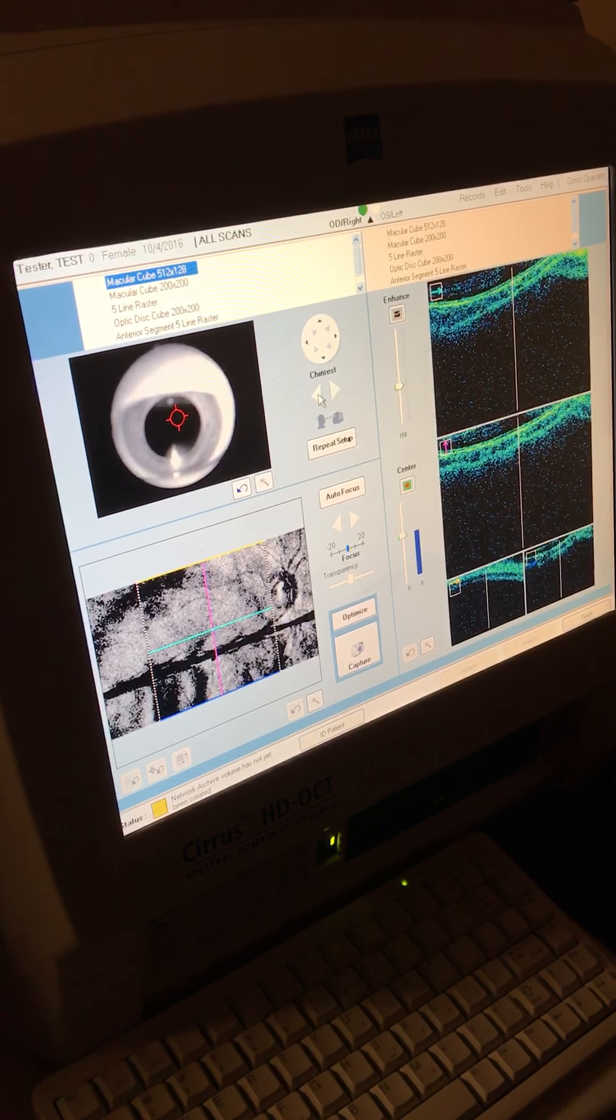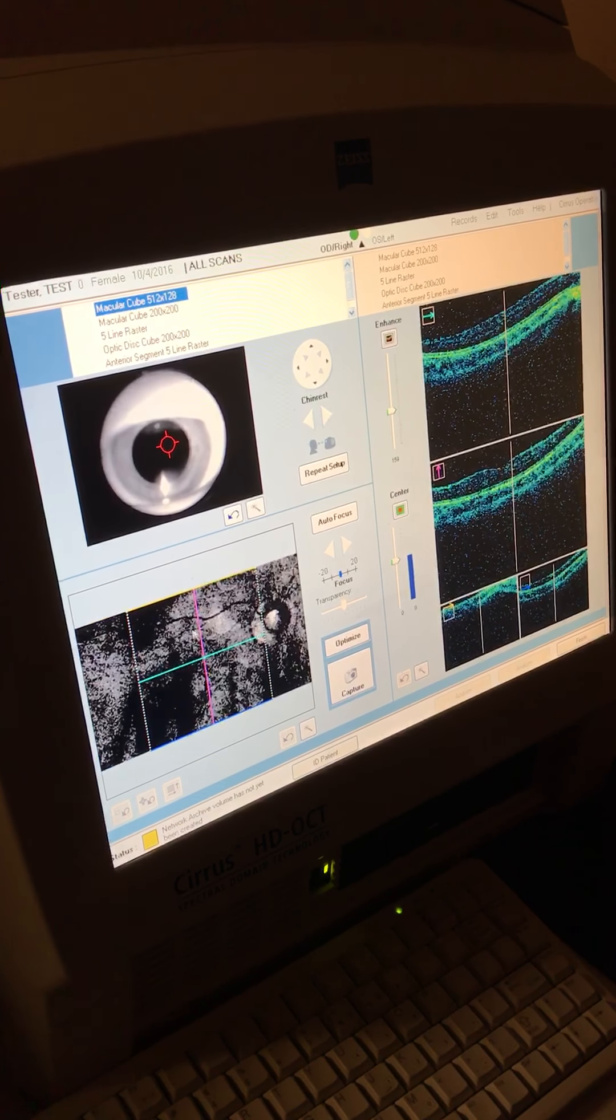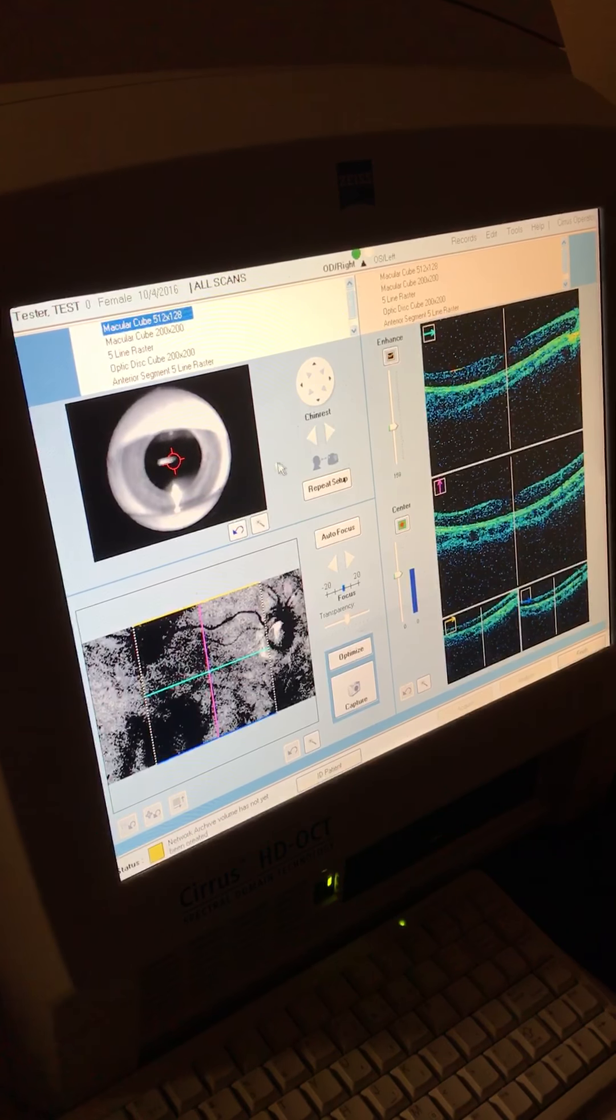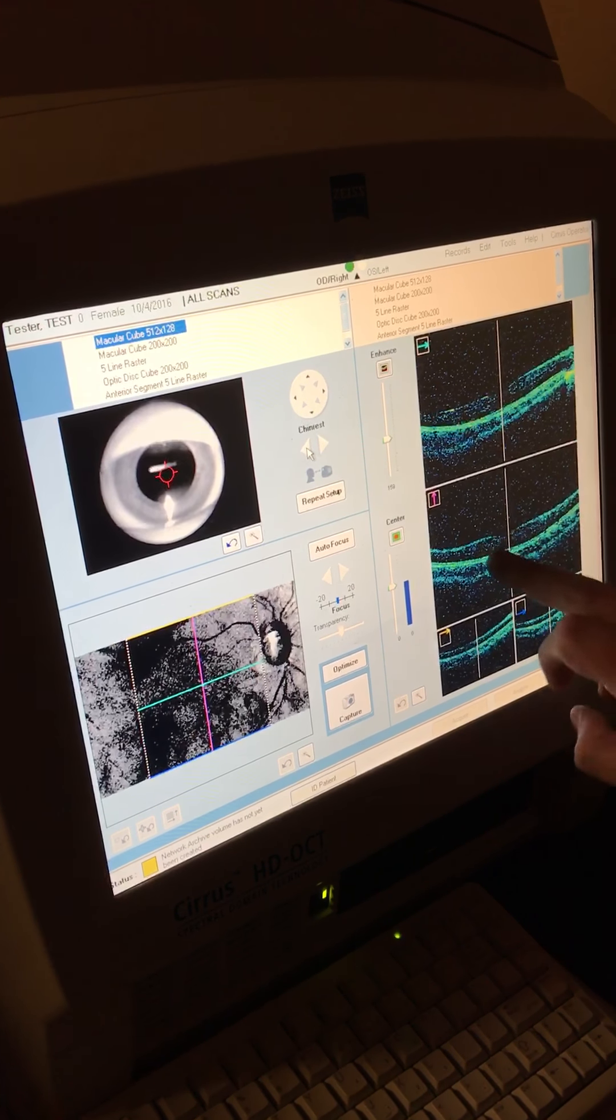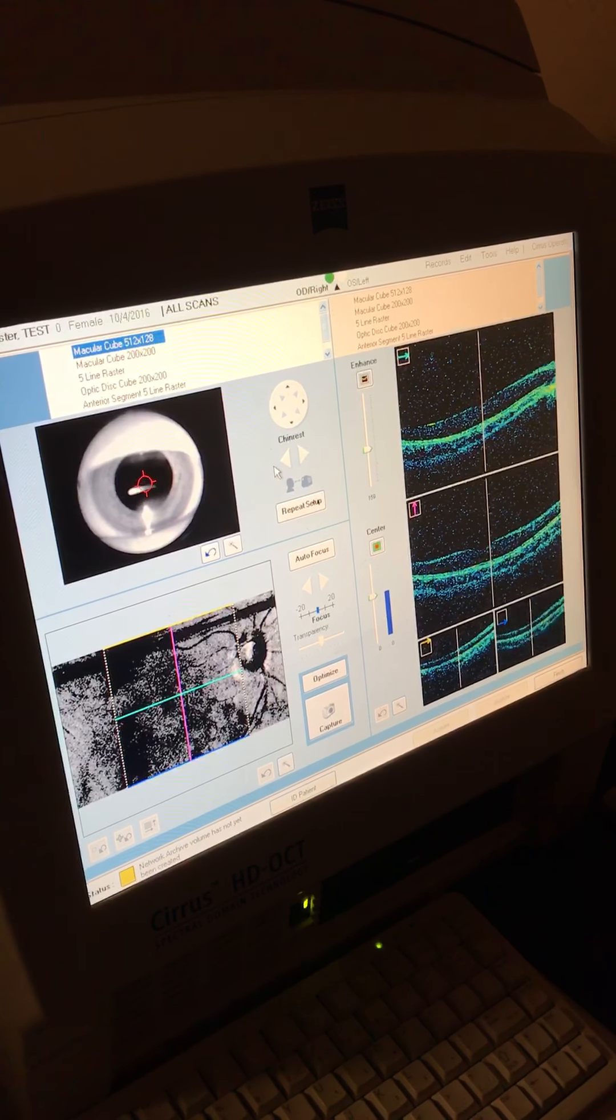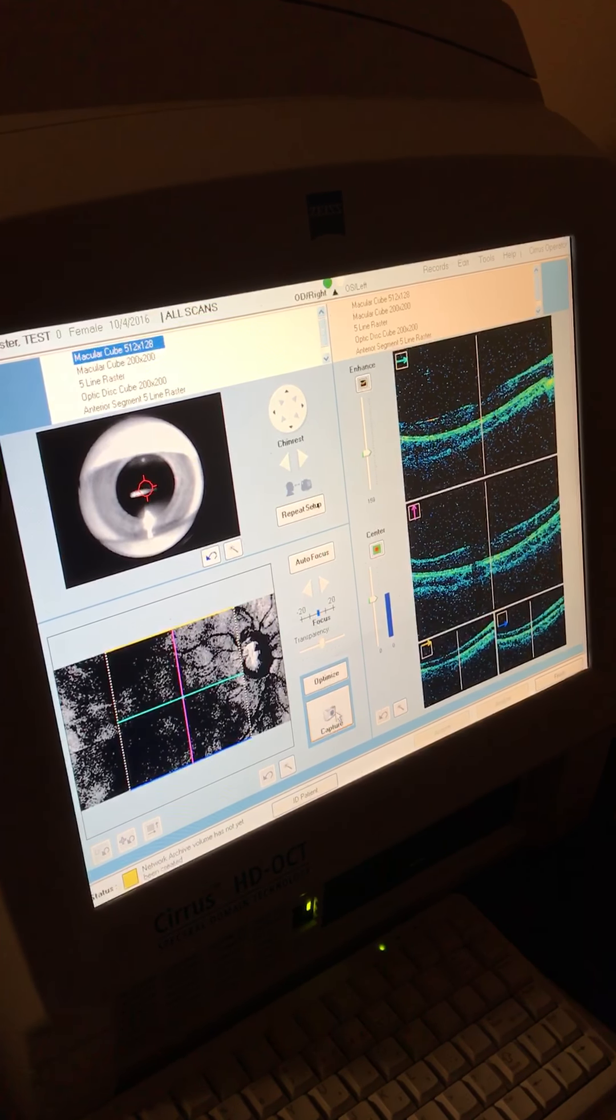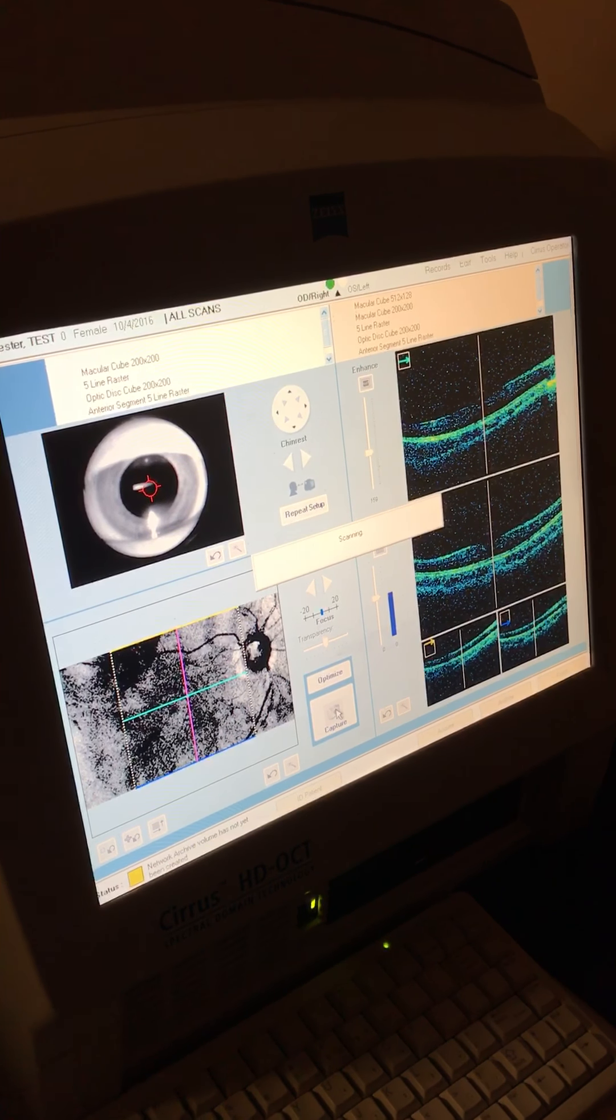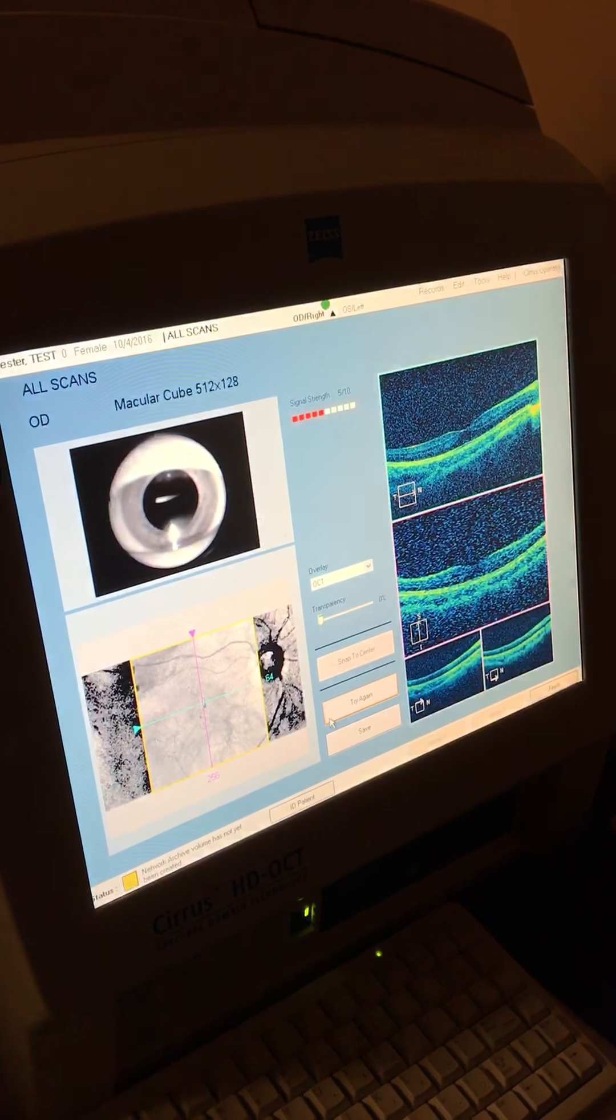And once she's in there, we'll get this scan here and a picture of her fundus on the left hand side. And what you want is you want all these scans to be in the middle on all four screens. And then we'll have the patient blink. And then just keep your eyes open and then we'll hit capture and you can sit back.